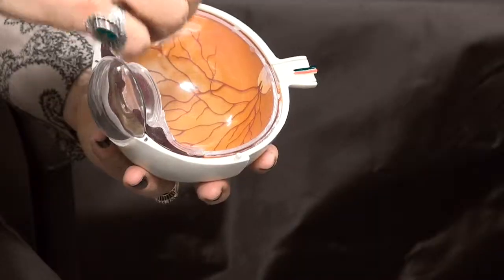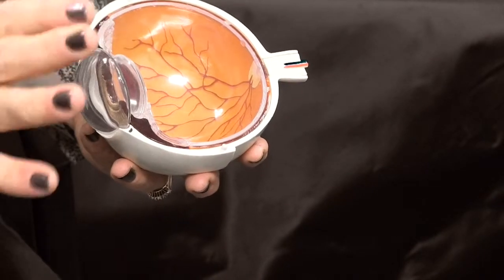To get your most pristine vision, you'd like to have no or minimal astigmatism and that focal length coming on the retina. So we do a lot of testing and studies to say how much astigmatism needs to be corrected and how do we best focus the light back here to give you the perfect implant in here for your best distance vision. Now, the laser is what it will do here. It can do two things. It can correct certain amounts of astigmatism, which is what the laser itself is actually approved for.